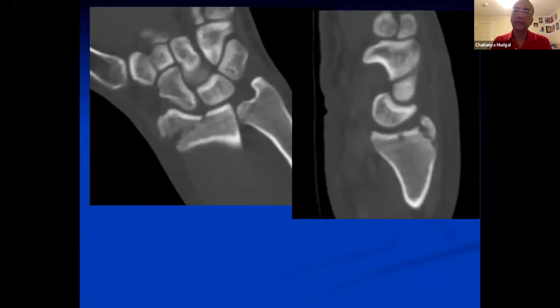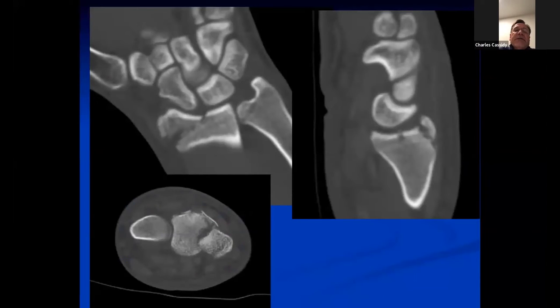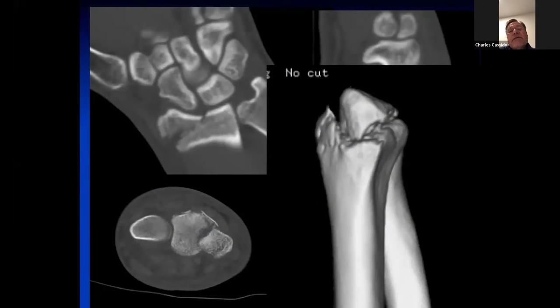Here's the CT. There's a marginal impaction fracture — sort of like an acetabular fracture on the sagittal views. You can see the arc is lost, so that's going to have to be part of the reduction. This is not so straightforward. You could use arthroscopically assisted — you're going to need to elevate it and graft behind that little fragment in fixation. And it's rotated.